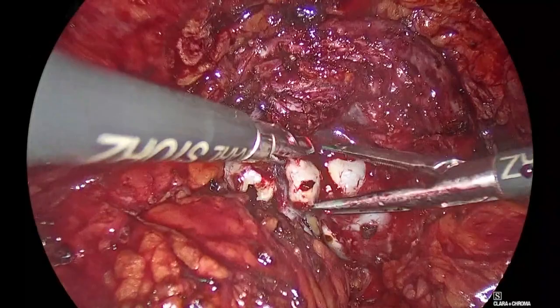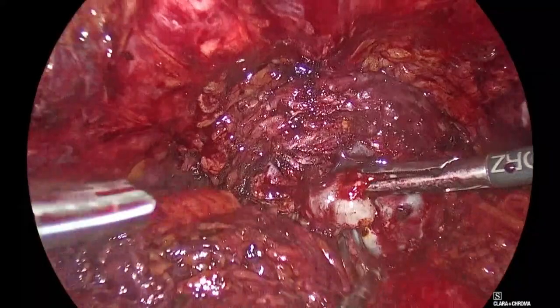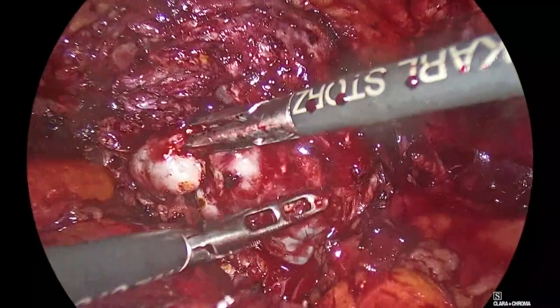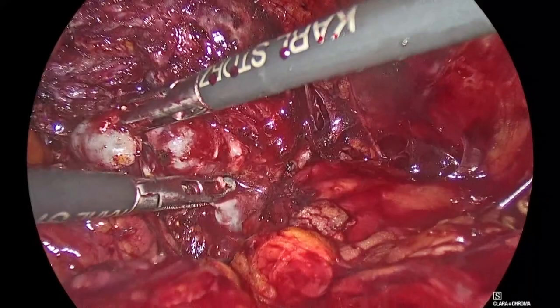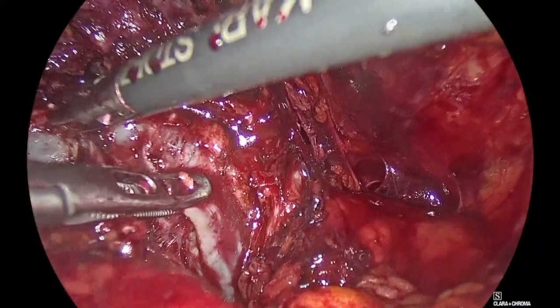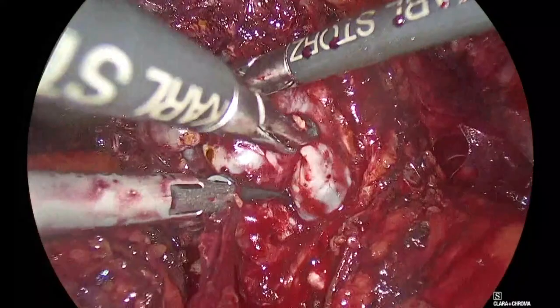In this case, my side. The angle looks like you're a bit short of space, aren't you? Yeah, because as I told you, I had this hernia, it's a multi-hernia patient here, eh? Which is not easy, and I could not develop my spaces to the right and left, so I don't have enough space, but it's okay. Don't change position, Panagiotis. You didn't see the initial image. The initial image was not nice. I didn't want to show you the initial image.